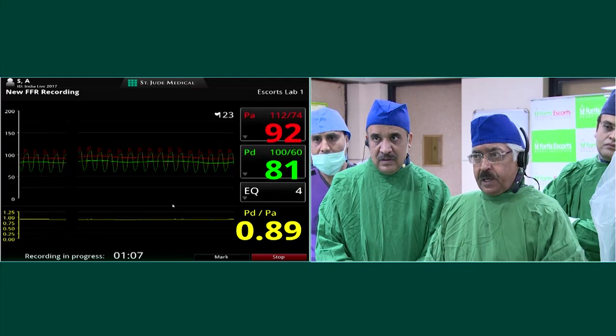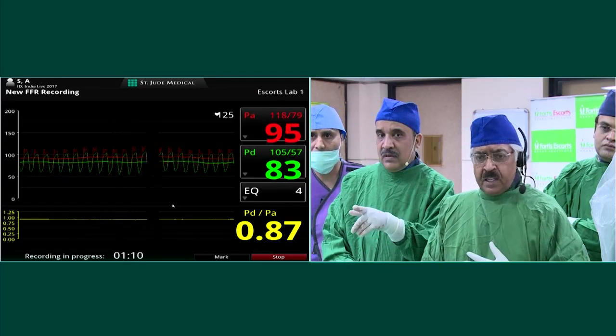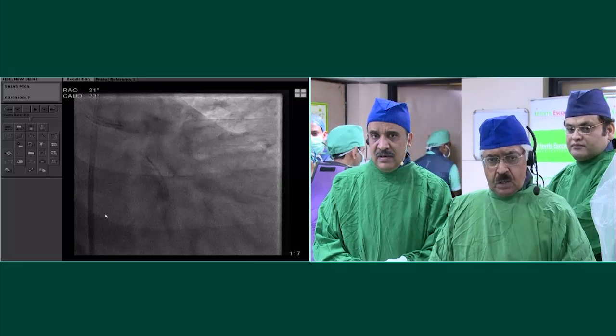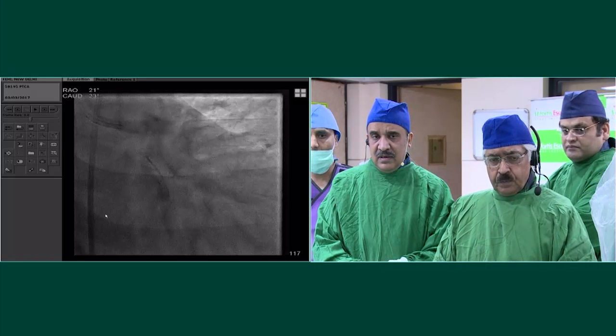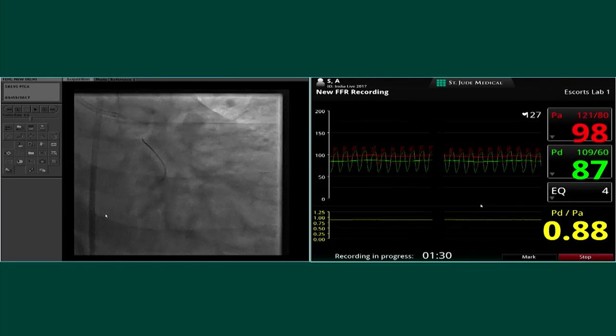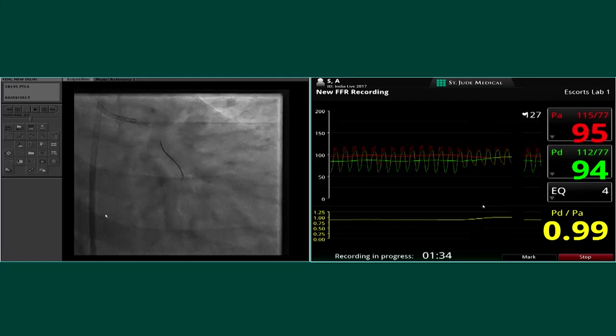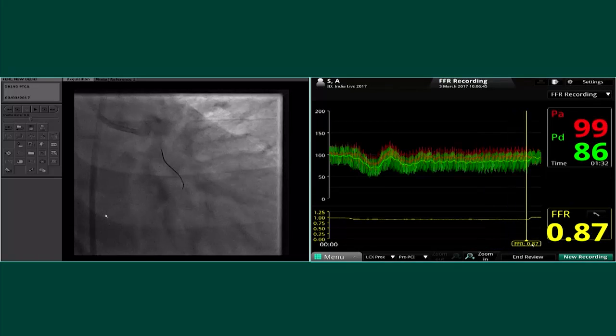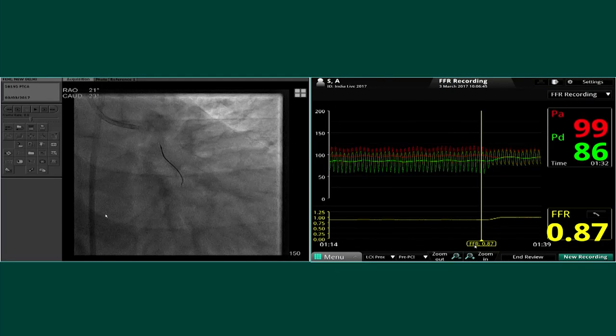I'm now on the fluoro, and I'm bringing it back. Can you remove me and show them the screen? Keep FFR and fluoro. Now you will see that I'm coming before the lesion, and I'm moving back, and now I'm before the lesion. We can stop the infusion. So what would you do? 0.89 to 0.9, a pressure drop of 10 millimeters, a young guy, a 42-year-old, visibly a high-grade stenosis.